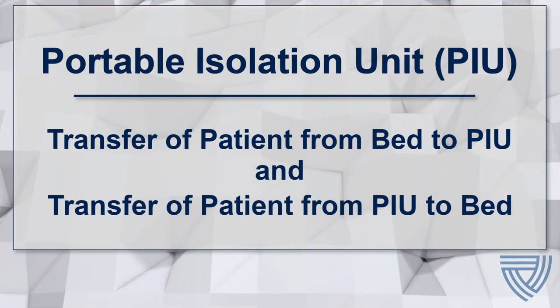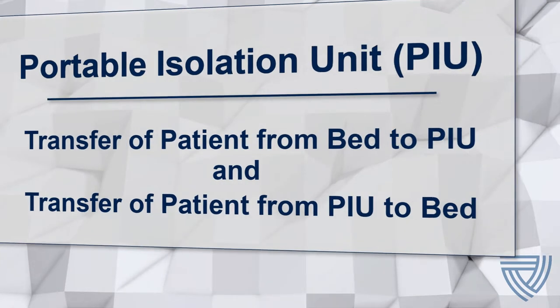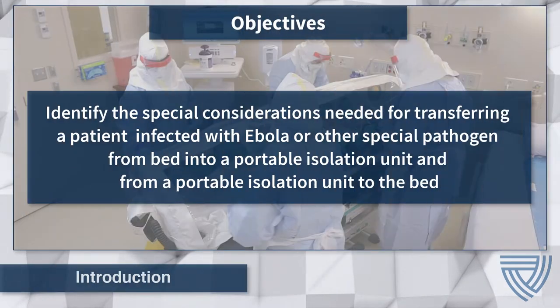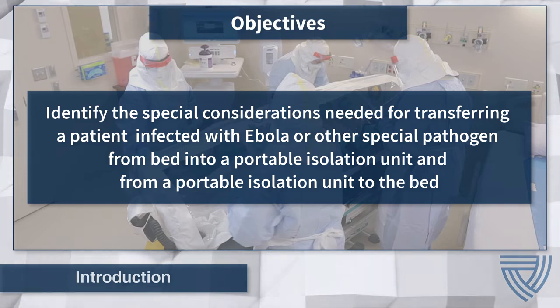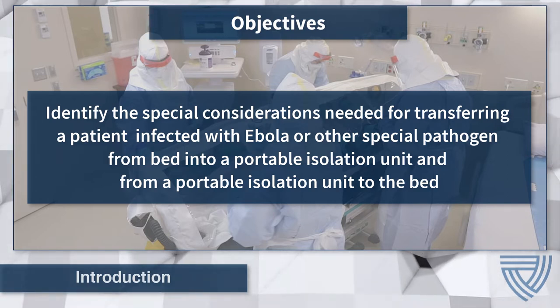Portable Isolation Unit. Transfer of patient from bed to PIU and transfer of patient from PIU to bed. In this video, we identify the special considerations needed for transferring a patient infected with Ebola or other special pathogen from the bed to a portable isolation unit and from a portable isolation unit to the bed.